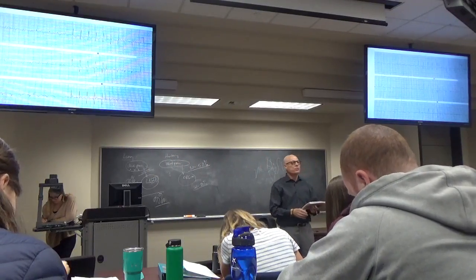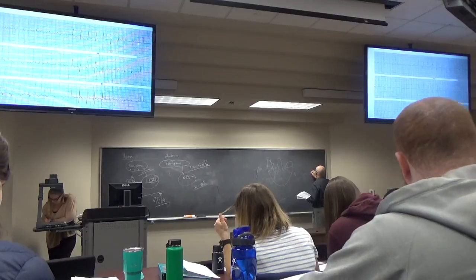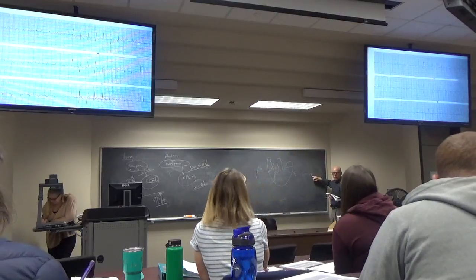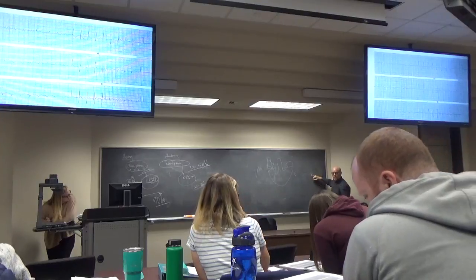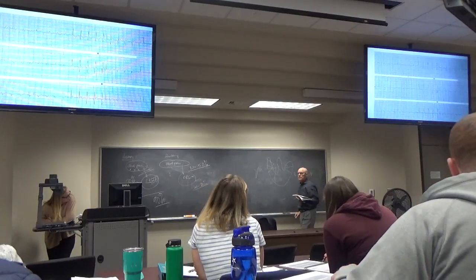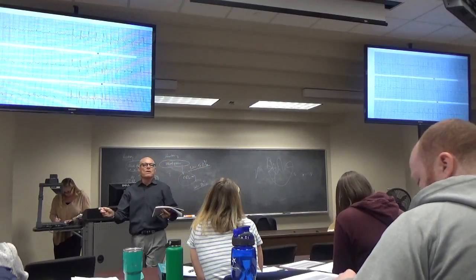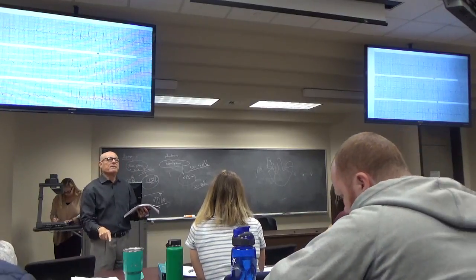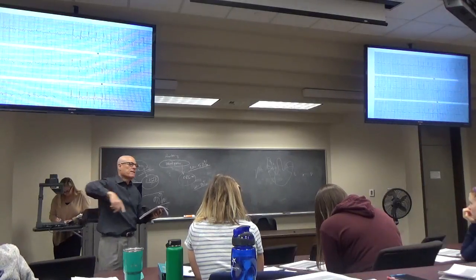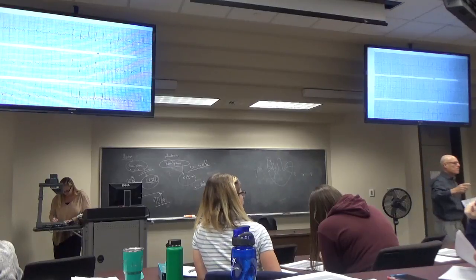I don't know if I should confuse you with this idea, but look at this. We've been talking boxes. Count them above and count them below. And in V6, this one would be negative down here. But the fact is that the area under the curve matters. And that S wave in V6 is twice as wide as it should be. So if the QRS was narrow, it'd be twice as deep. So that big slurring, that big deep S wave like this is an important finding for a right bundle branch block. The only time you won't have rabbit ears is if the anterior wall is infarcted.